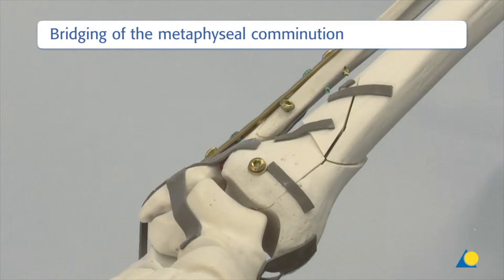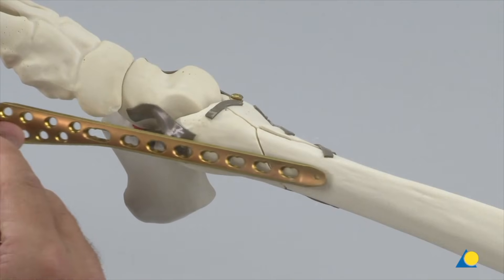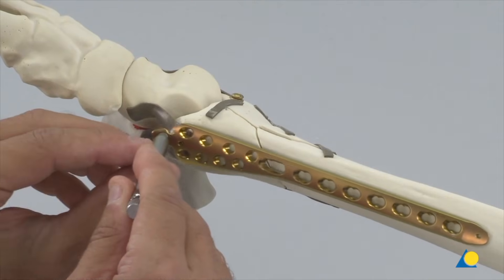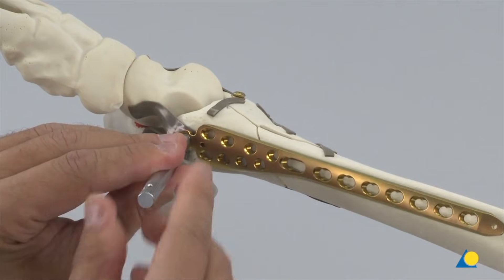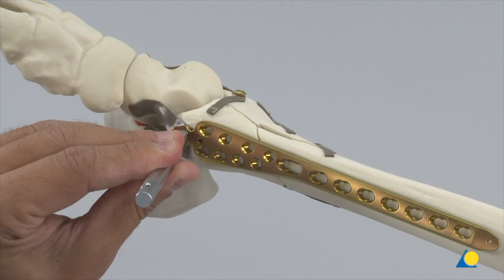Once the articular fracture has been anatomically fixed for absolute stability, the comminution is bridged using a MIPO technique. After verifying the overall axial alignment with image intensification, the pre-contoured distal tibia LCP is introduced by sliding it subcutaneously along the medial aspect of the tibia.